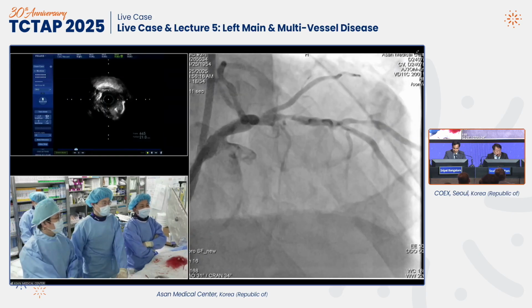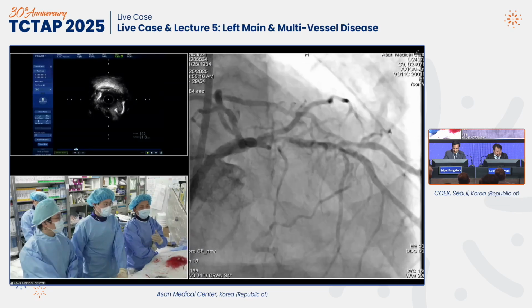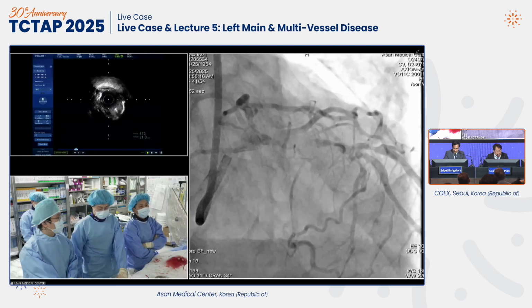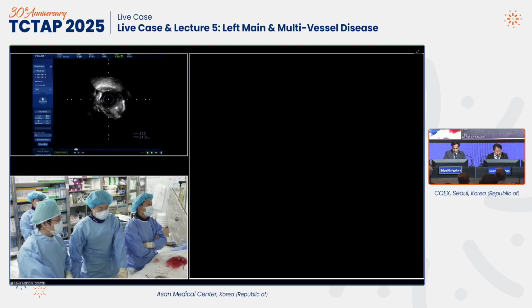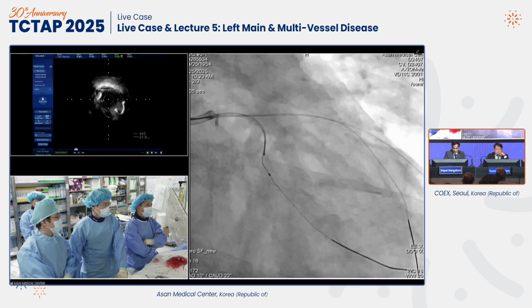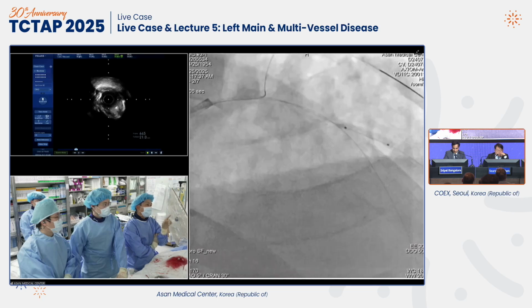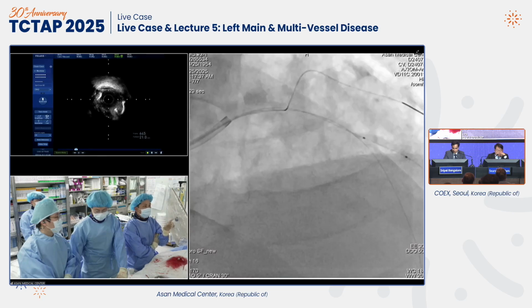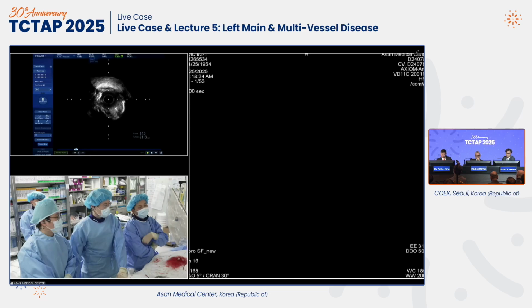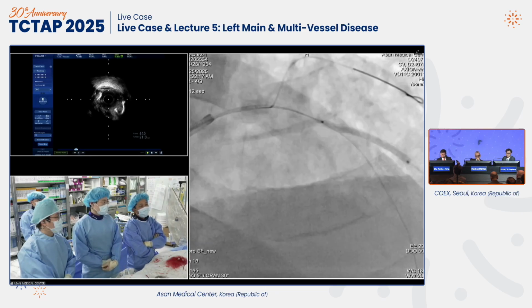I have to deal with many diseases, but I want to concentrate on the big things, not small things. So for the diagonal branch, I do not want to add a two-stent or other complex situations. So I applied a drug-coated balloon. I set the size by the vessel size, because there was some negative remodeling and the vessel size was 2.5 there. So I applied a small compliant balloon and then a 2.5 paclitaxel drug-coated balloon for 1 minute.